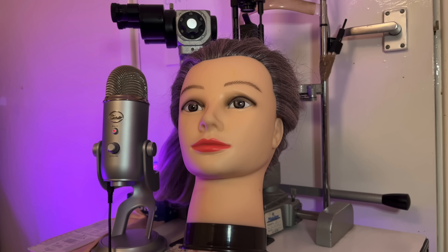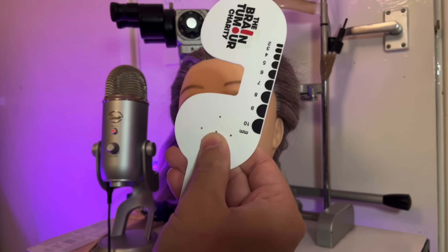Hello, welcome to the clinic. Today we're going to be fusing some clinical skills with some ASMR. We're going to be taking some eye and head measurements using the equipment set out here. We have our beautiful volunteer, so let's get started first with the cover test.